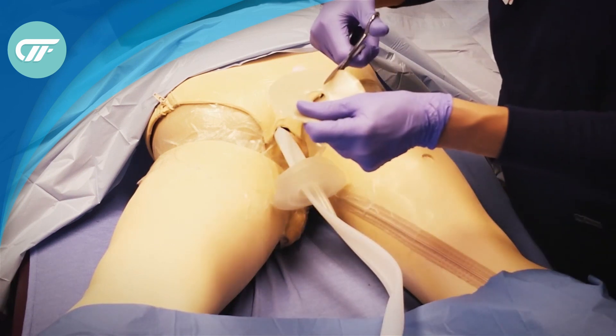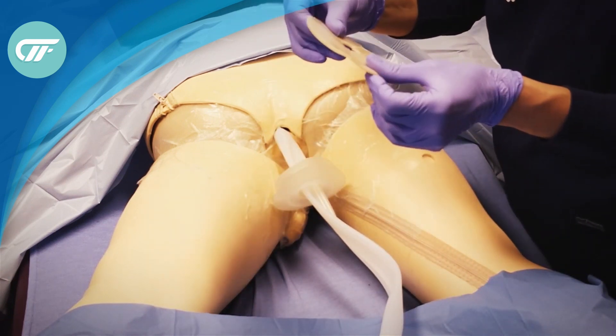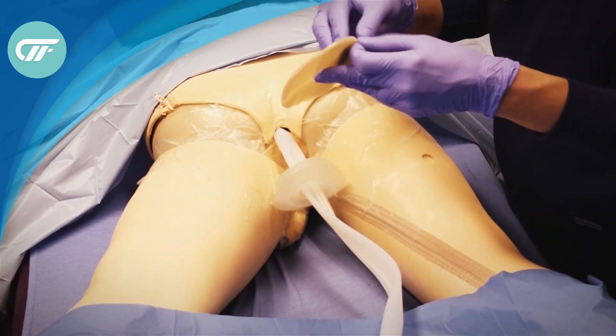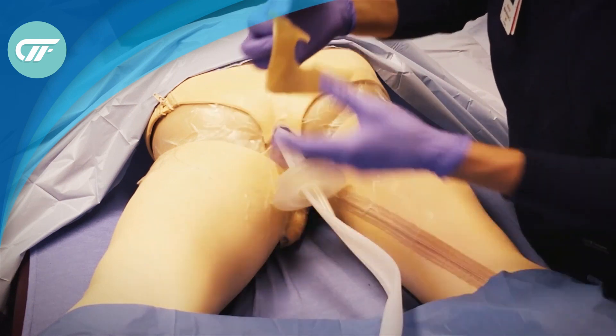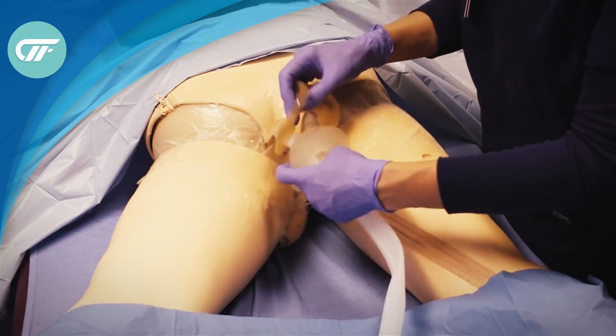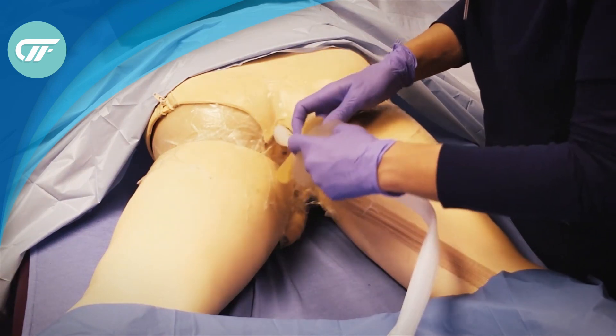Then you trim the hydrocolloid ring. I prefer this flat four-inch hydrocolloid ring — it seems to help me get a seal better. And I place it around the top flange of the fistula funnel.